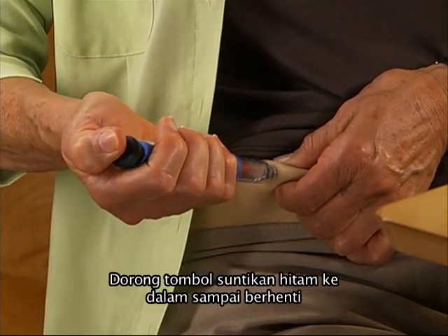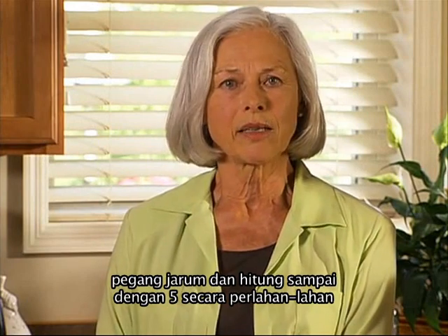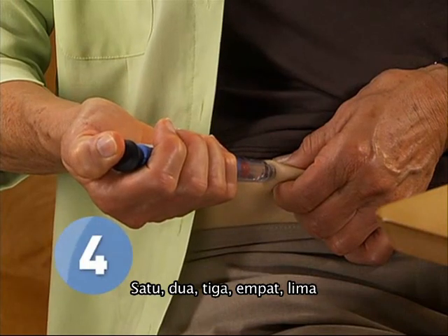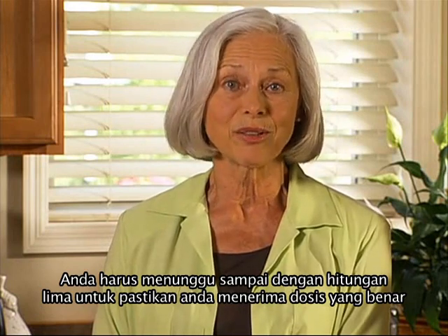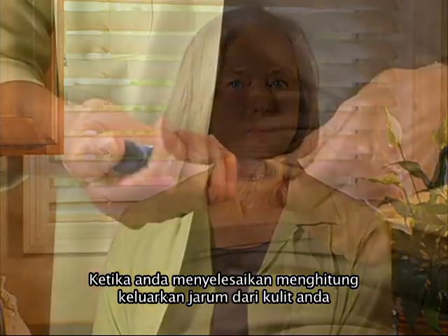Push in the black injection button until it stops. Hold it in and count to 5 slowly. 1, 2, 3, 4, 5. You must wait until the count of 5 to make sure you receive the correct dose. When you have finished counting, remove the needle from your skin.